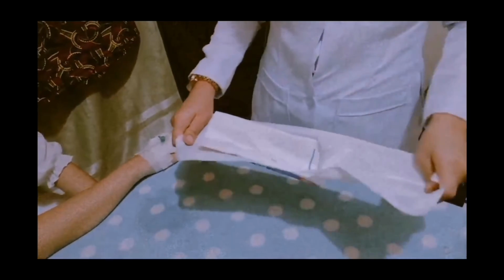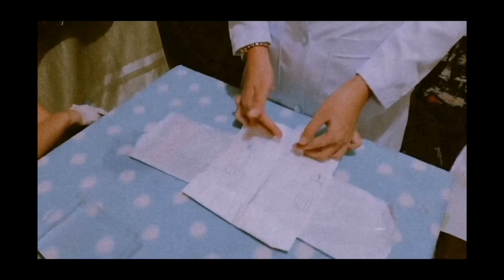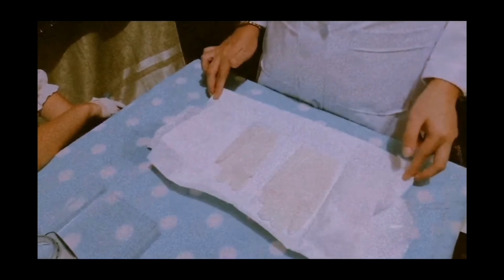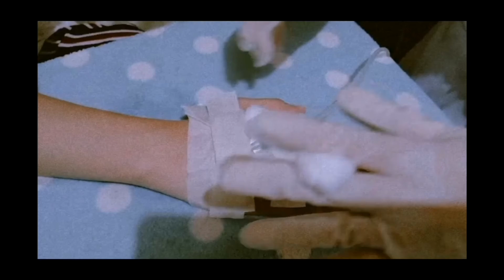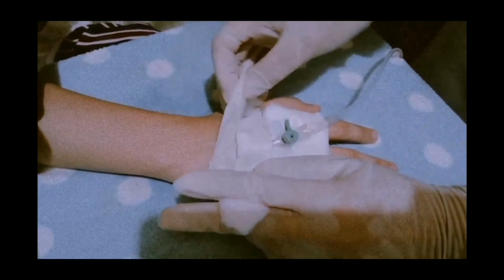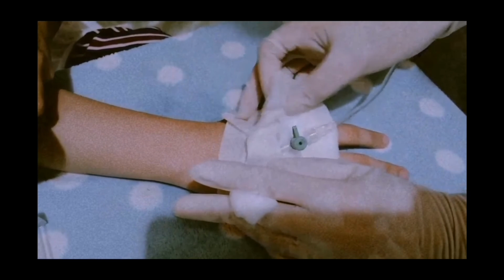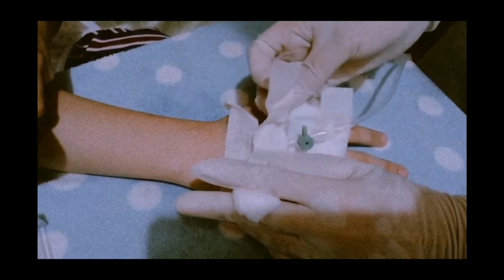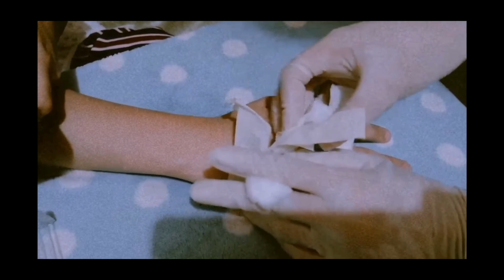Next procedure is to don gloves and clamp the infusion tubing. Clamping the tubing will prevent the fluid from flowing out of the needle on the client or bed. Next is to hold a swab above the venipuncture site. Withdraw the needle quickly by pulling it out along the line of the vein.